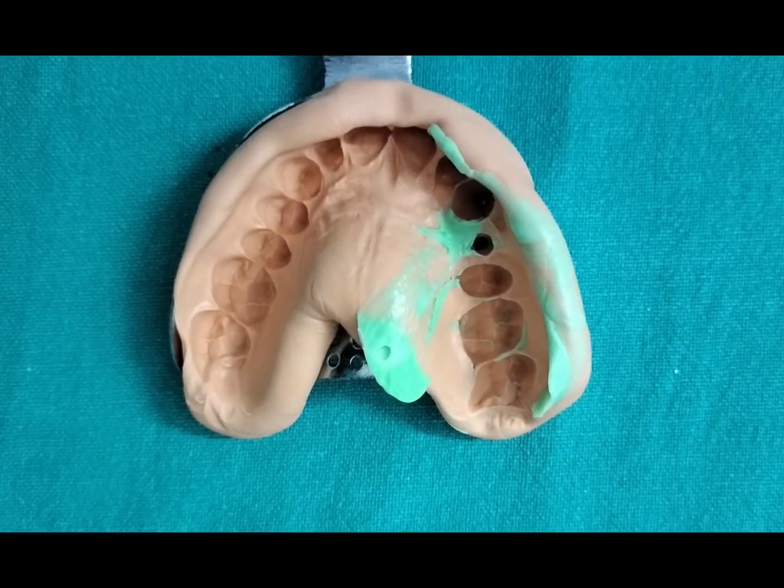I am Dr. Vijay Prakash, and in implant prosthodontics, obtaining an accurate impression is critical because even a small error can lead to a misfit of prostheses. Today we'll discuss why implant impression is important, open tray technique, closed tray technique, their advantages and disadvantages, and Viva questions and some exam tips.